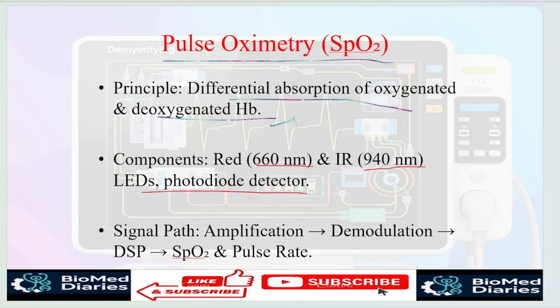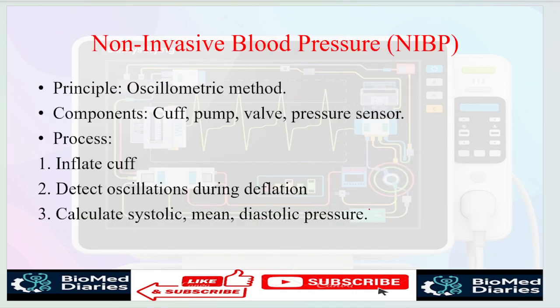LED emitters and photodetectors are being used. The signal path is amplification, demodulation, DSP, digital signal processing, and the display will show SpO2 and pulse rate, like pulse oximetry, a non-invasive parameter.